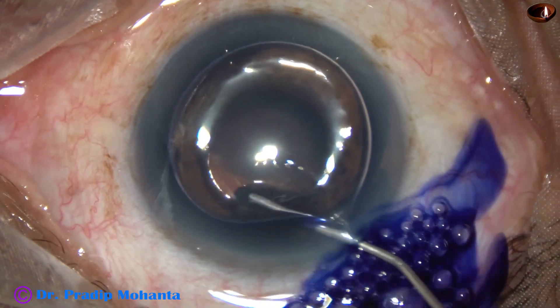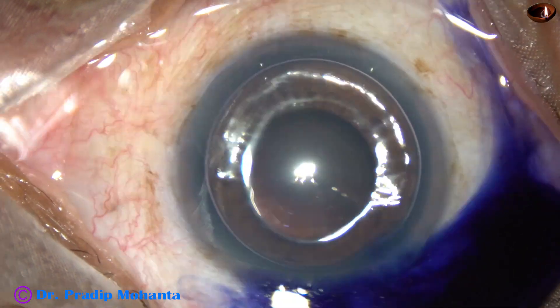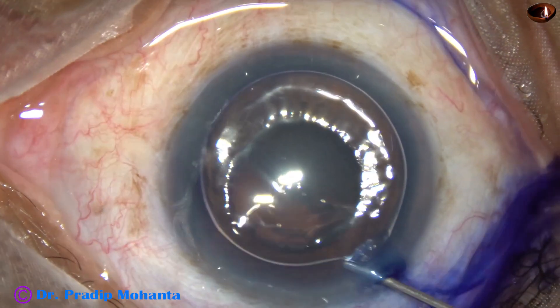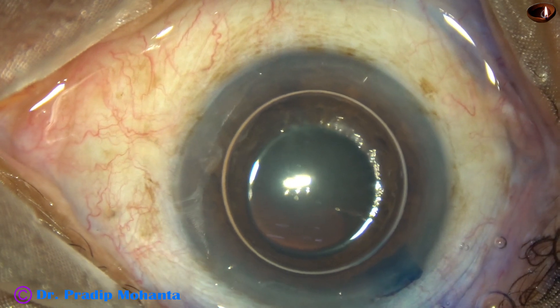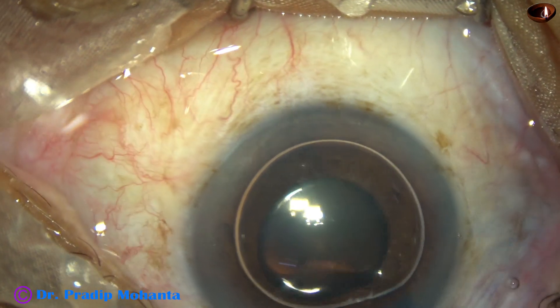This is trypan blue dye underneath an air bubble. And now this is adrenaline. So we have used a lot of agents to dilate the pupil without any effect. The size of the pupil is the same.